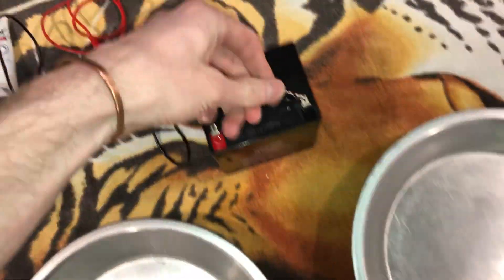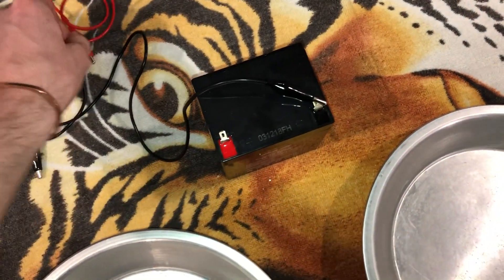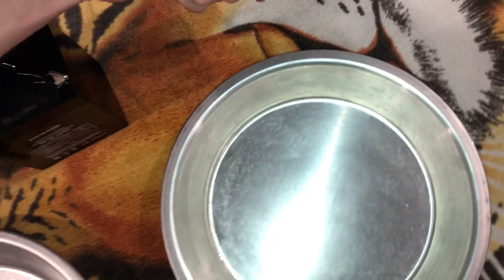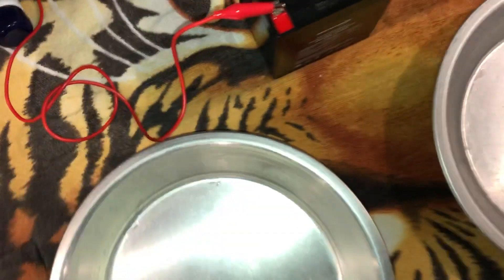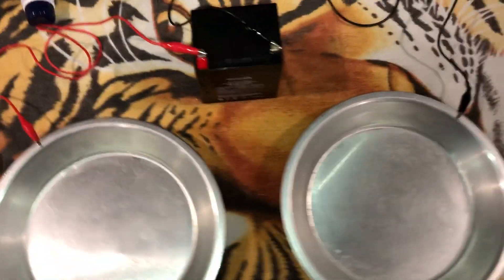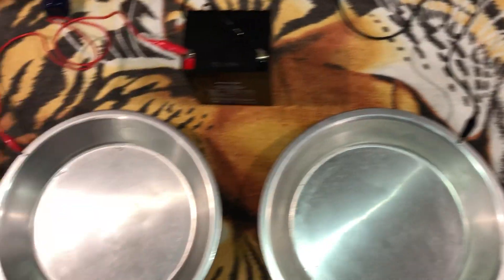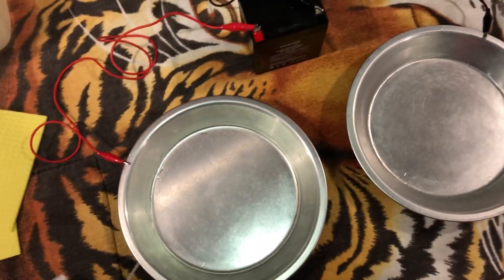Hook up your alligator clips — start on one side, hook it up to one pan, take the other and hook it up to the other pan. The important part to remember is you don't want these touching. If they do touch, they will ruin your battery pretty quickly and you'll get sparks flying everywhere.